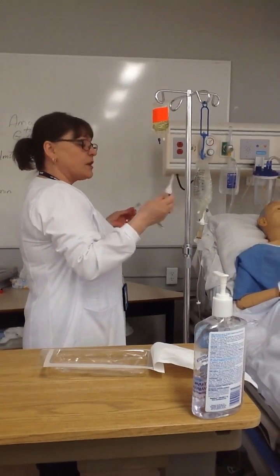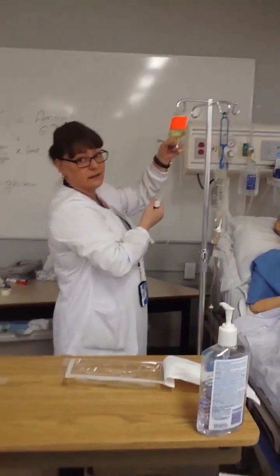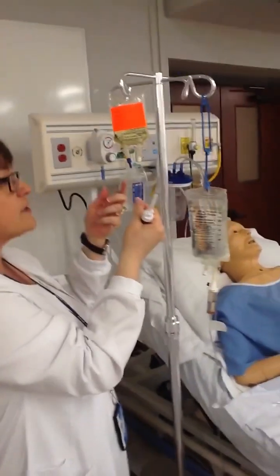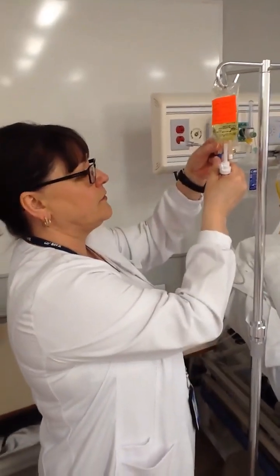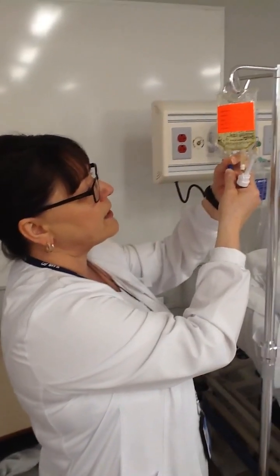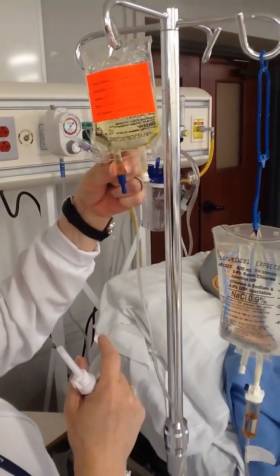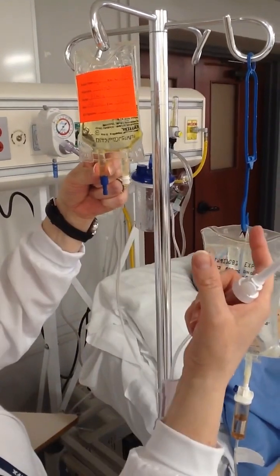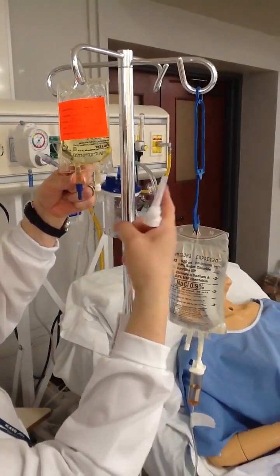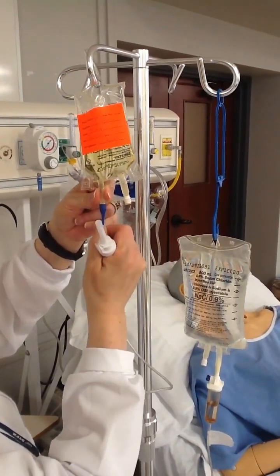So the technique is pretty straightforward. We have a sterile spike under that cap, and we have a sterile port under that little blue tab. And so the camera's going to come in here so you can get a good look at it. You're using all of your fingers so that you get really good at using all of your fingers. So my non-dominant hand, or my left hand, is holding the port at the hardest part of the plastic where it's more firm. It's softer up here, it's harder here. And so my thumb and my index finger are holding onto that port. My right hand is holding on to the spike, the chamber I should say, and you can see the spike right here. So my right thumb and index finger are going to pull that little blue tab off.